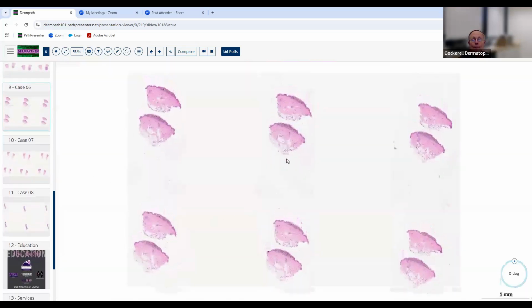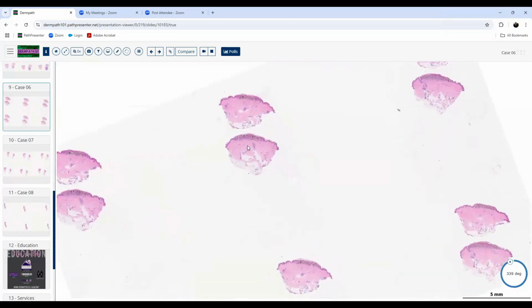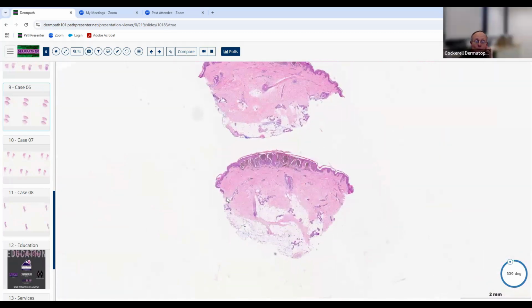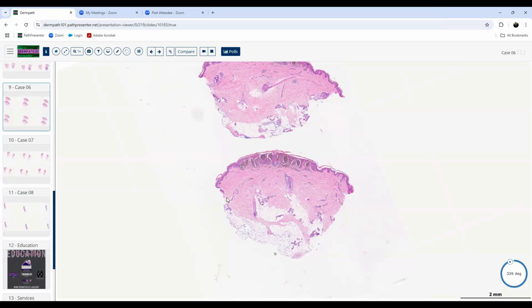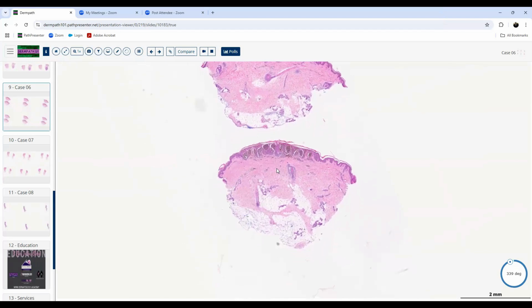Okay. We'll do this one. Good morning. I can take this one. So this looks like a punch biopsy, possibly from the trunk or extremities. Good. It could be an excision actually too, by the way, a small excision. It looks neoplastic. From this power, it looks pretty symmetrical, sharply demarcated or well circumscribed, and pretty small. So overall I favor benign.